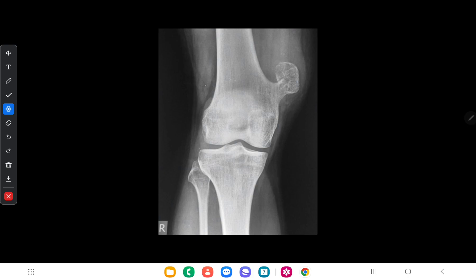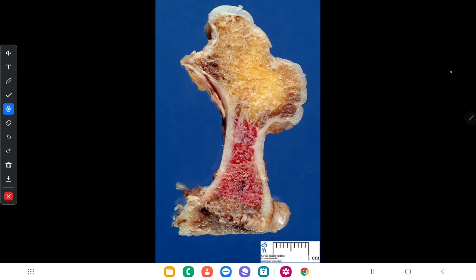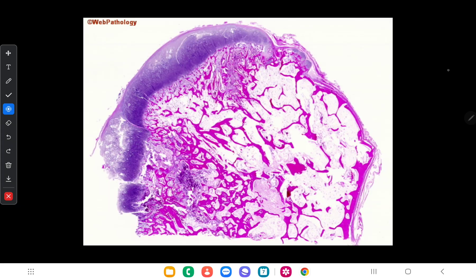Here is an X-ray of osteochondroma showing it has grown out from the bone in a mushroom-like structure. The gross appearance shows osteochondroma is an exophytic lesion with a cartilaginous cap. In the microscopic view, you can see the cartilaginous cap and the mature trabecular bone underneath.